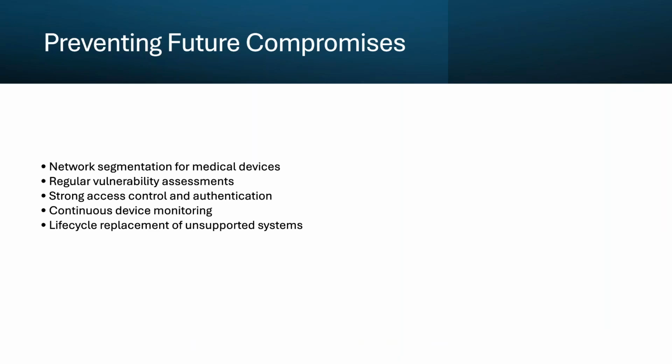We conduct regular vulnerability assessments. Our security team continuously scans and evaluates our medical devices for known vulnerabilities and weaknesses. This proactive approach helps us identify and fix problems before attackers can exploit them. These assessments should be scheduled regularly and after any significant changes to the device or network environment.